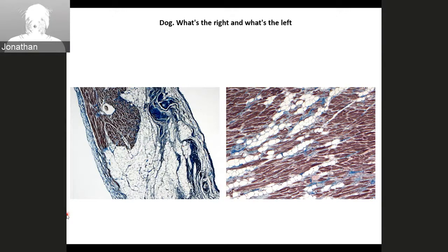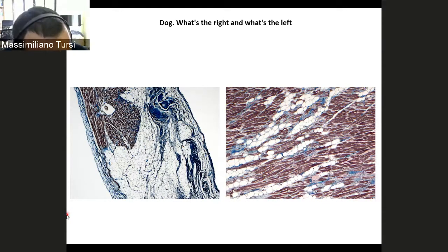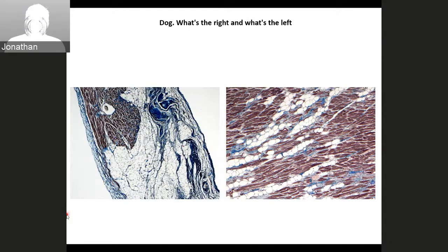Yeah, I have to check. But is there also a negative control? I have to double check. I think it's a very small study with a couple of dogs, mainly to look at microRNA.